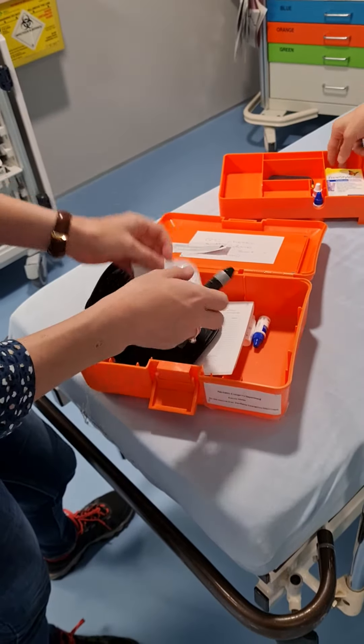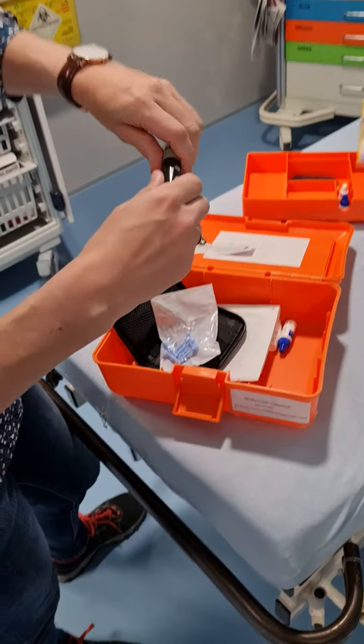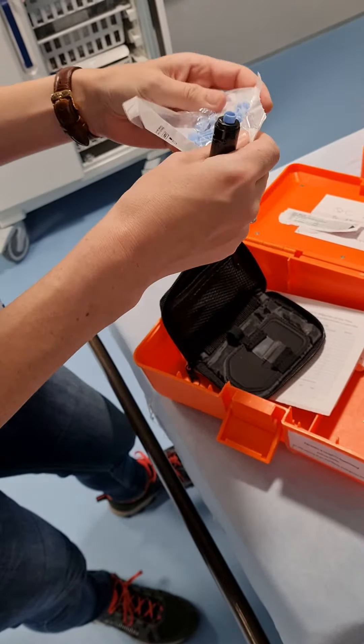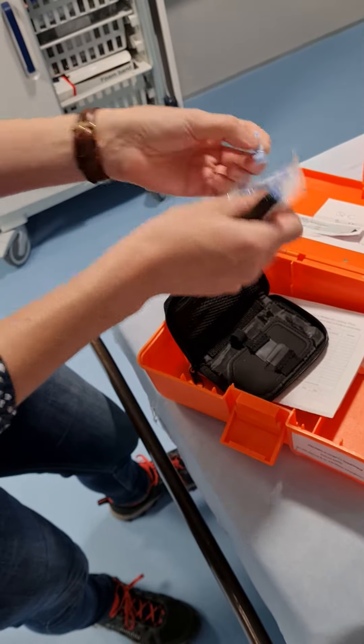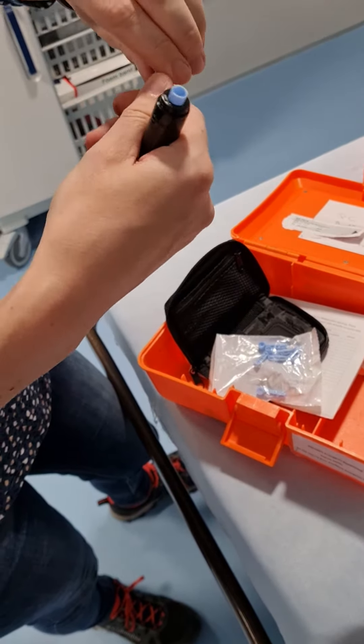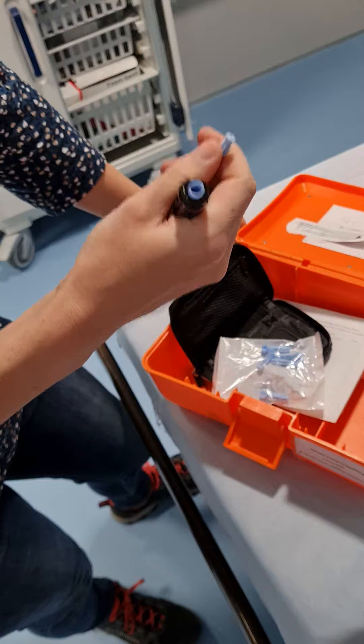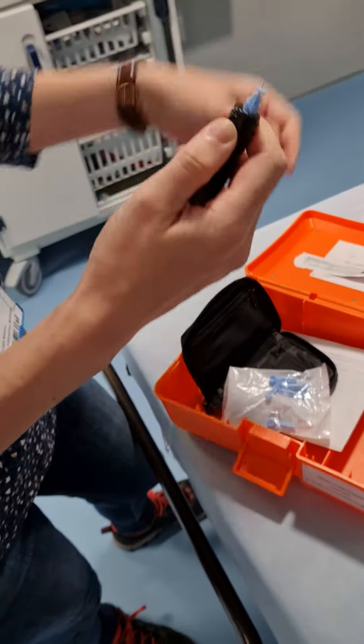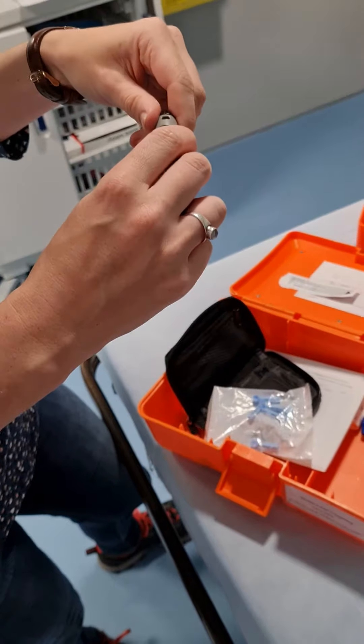Firstly, you're going to pull the top off, just like that. You get your lancet, put it through here, and you've made a hole. You just twist the top off this, and you've got your little needle on top there. You pop it inside like that, and then pop the top back on.